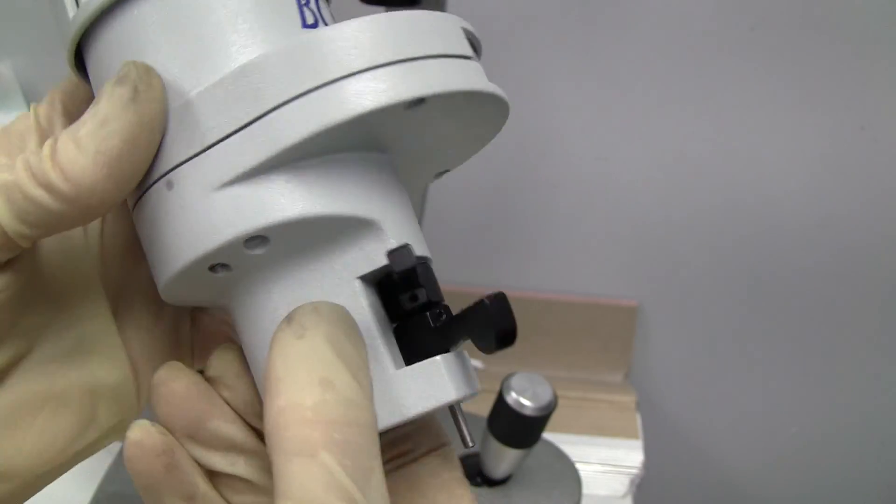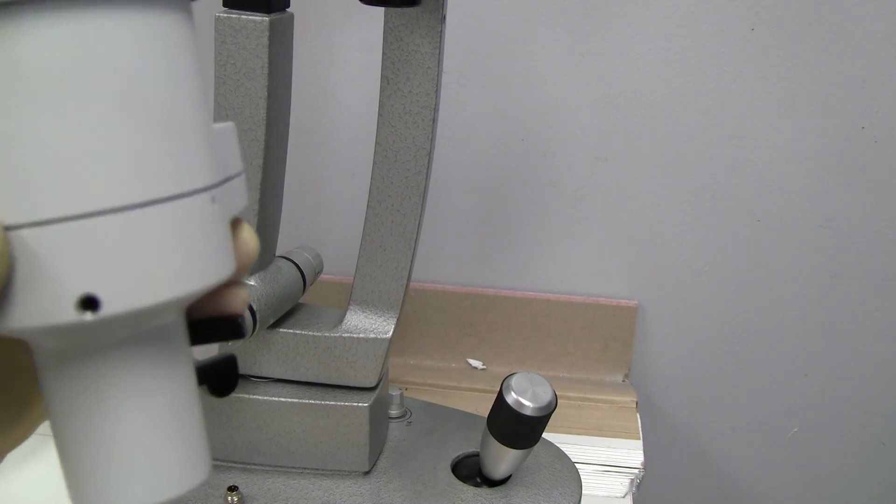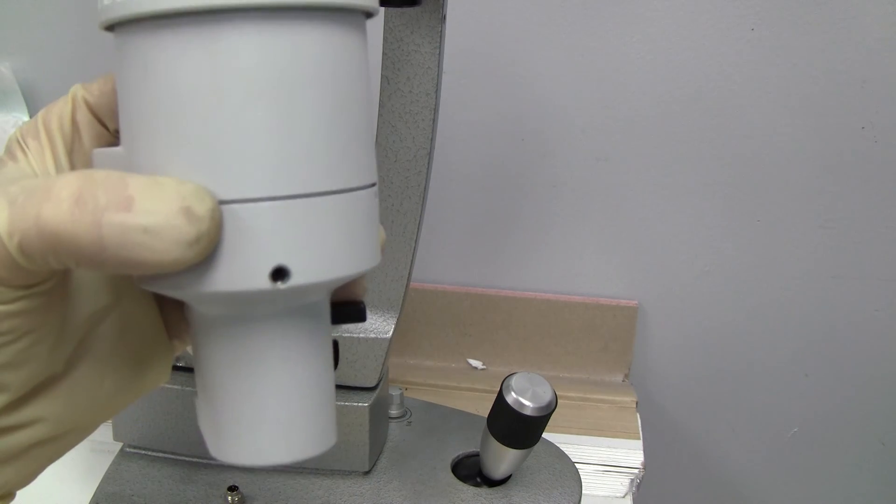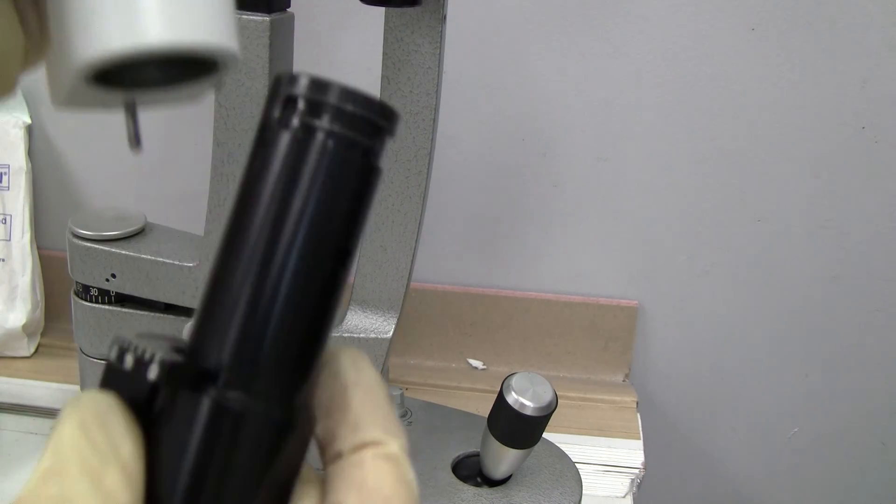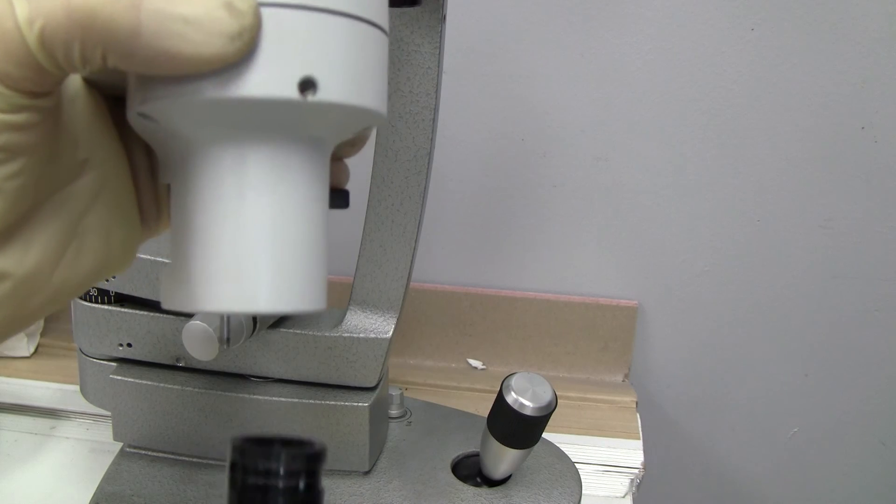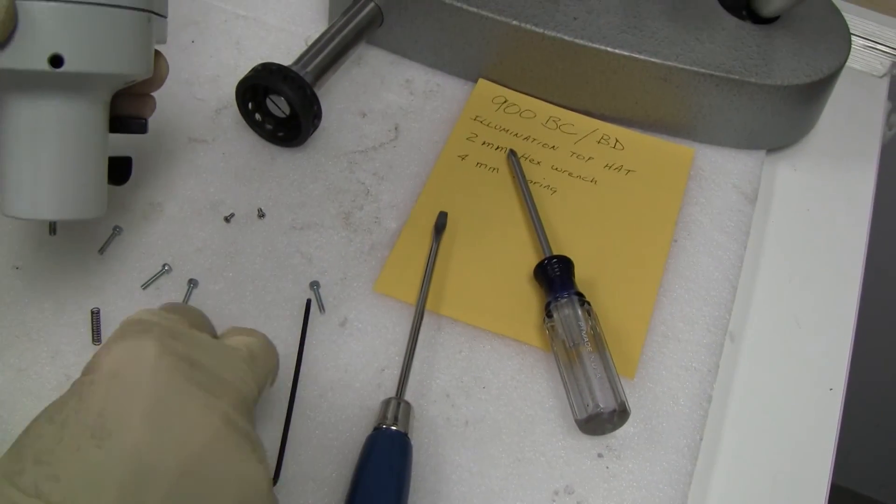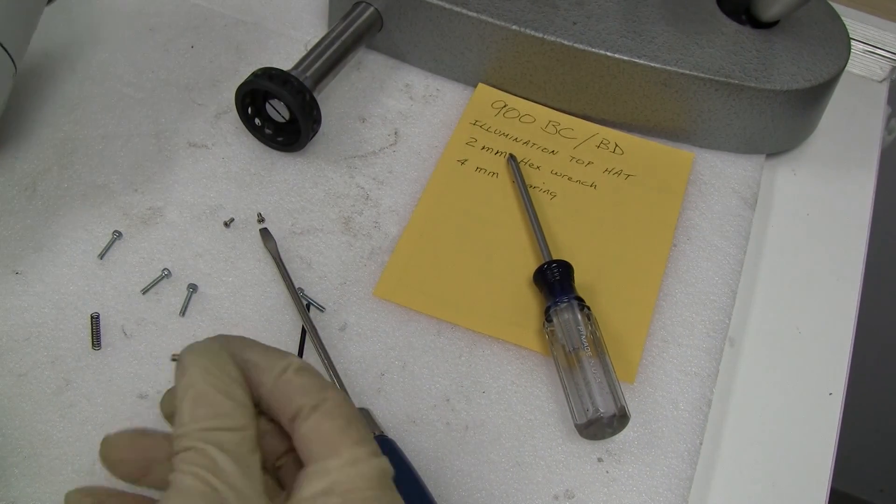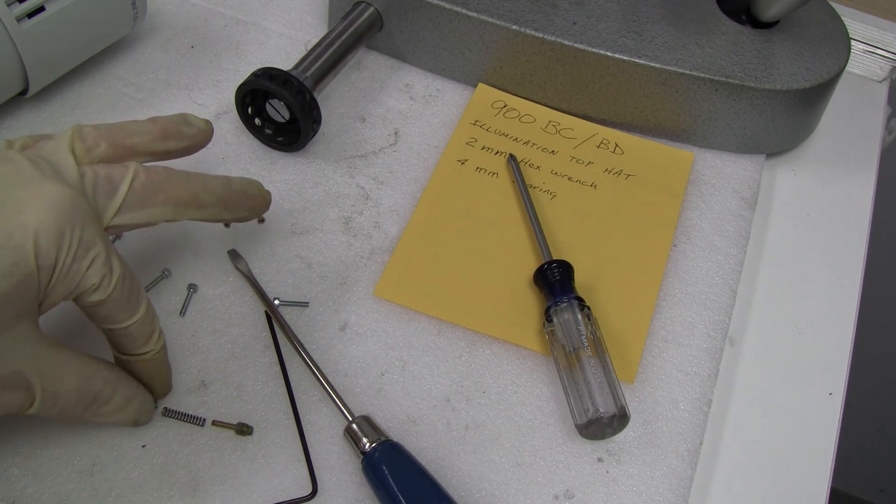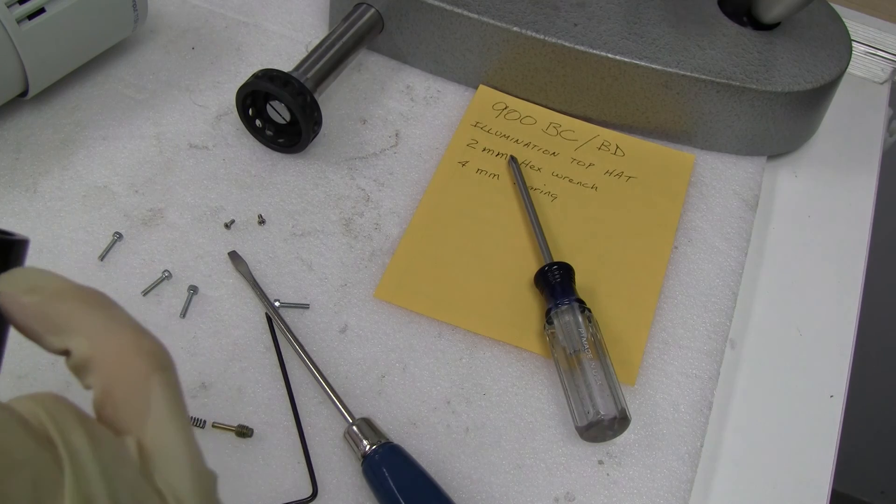Take all those four out. If you wanted to take your illumination head off, there's a lock screw in here with a bearing that keeps it on your tube. And to get that out, we have this screw.